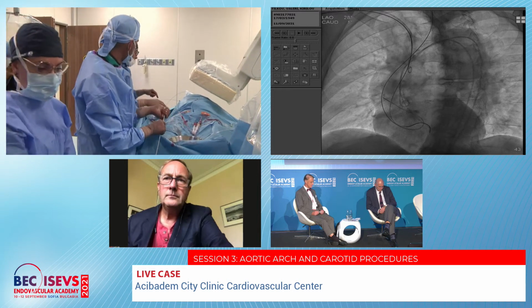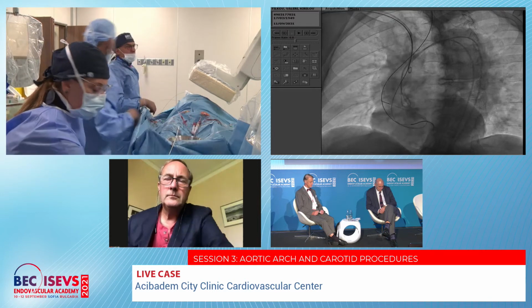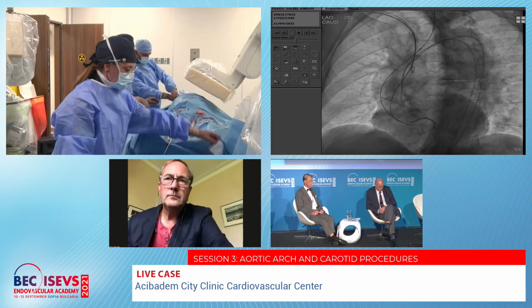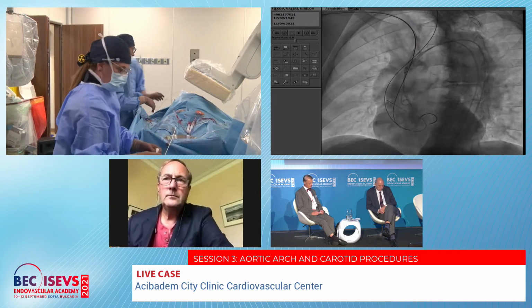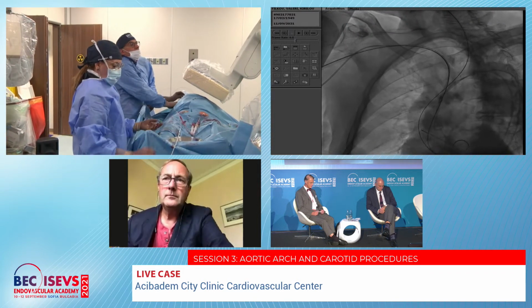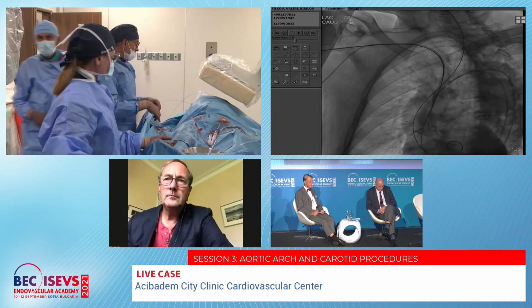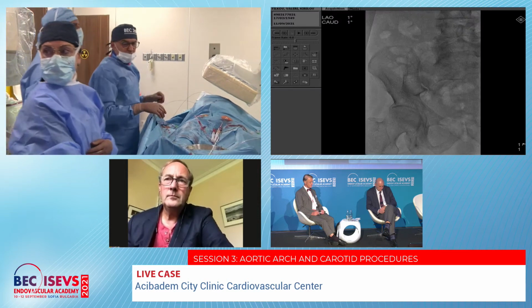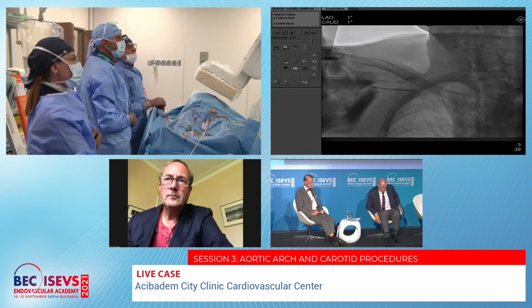And if not occluded, it will fill the aneurysm, and of course it's not a good idea. We can show the puncture of the subclavian artery, using one trick. You see, we placed the sheath into the subclavian artery. In fact, we use this from the AAA treatment to put the grafts sheathless. It's an interesting maneuver.